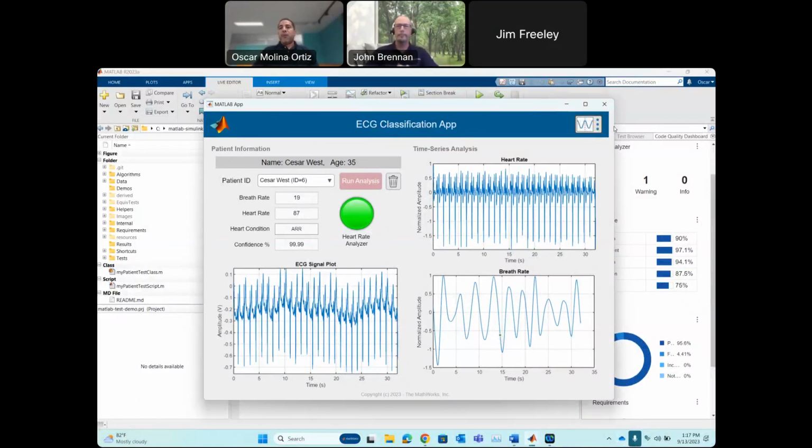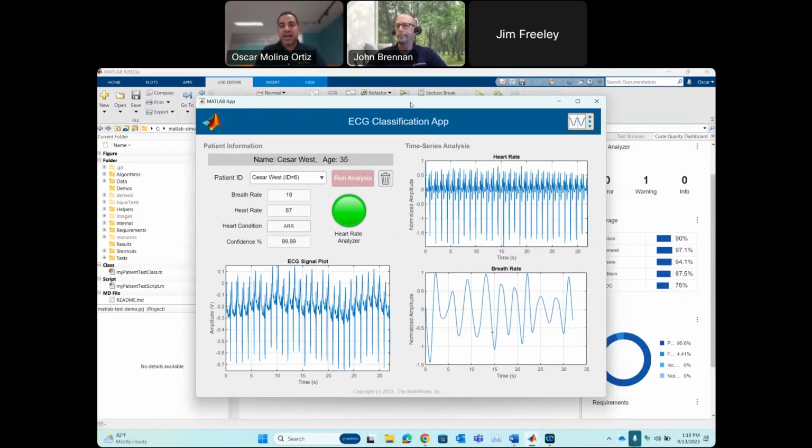Awesome, awesome. Right, so hello everyone. What we're gonna do in the next few minutes is to put all of the concepts that John was describing into context and into practice actually. So John mentioned that for that objective, we're gonna be using this application. And it seems a little bit too complex because it has so many moving parts. So let me first break them down for you to see what's happening with this application.